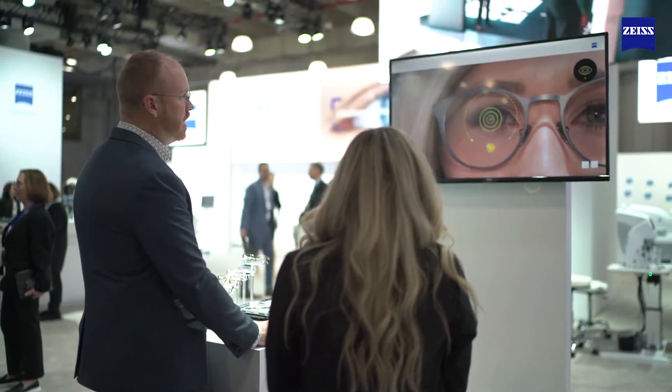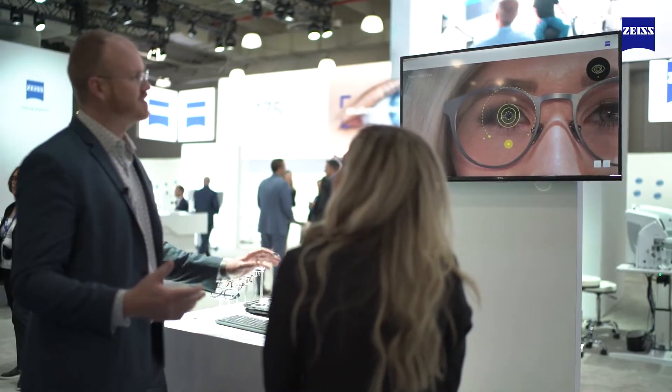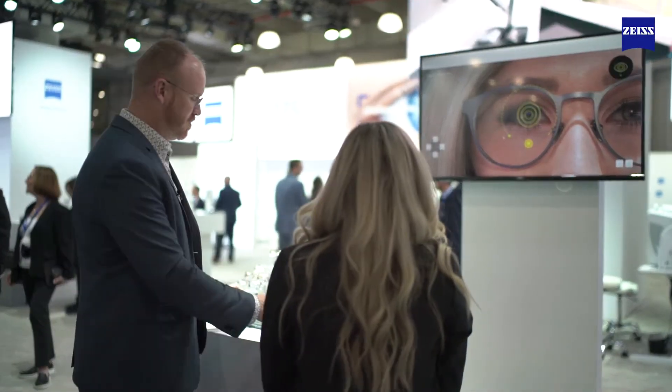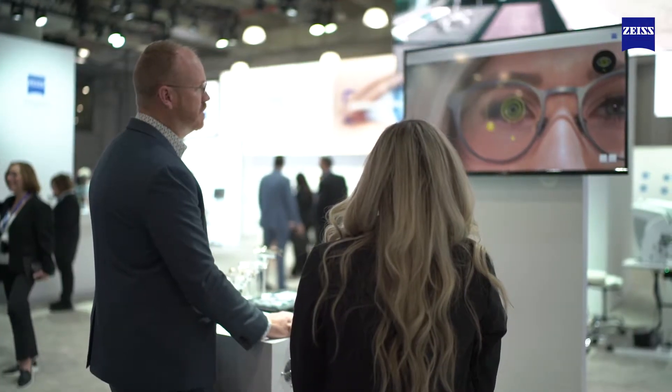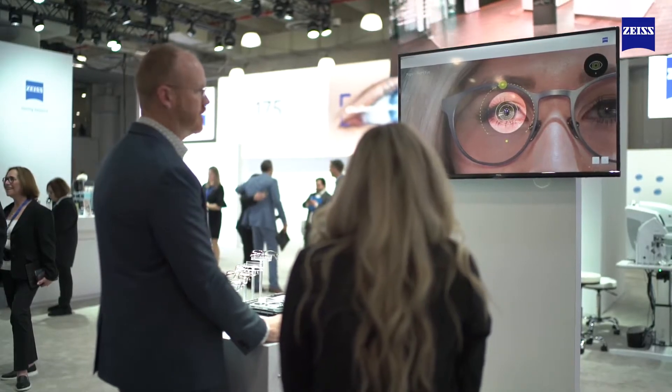One cool feature about our centration technology is when we dot pupil center — for folks like us who have colored eyes it's a lot easier to differentiate the pupil from the iris. But if you have a patient with darker eyes, we can increase the contrast to brighten it up and show exactly how it works.